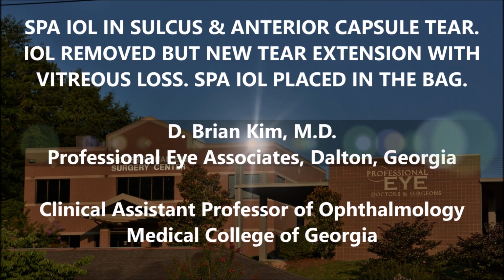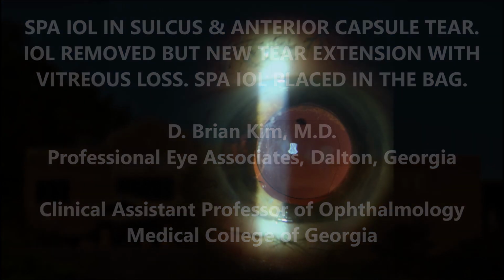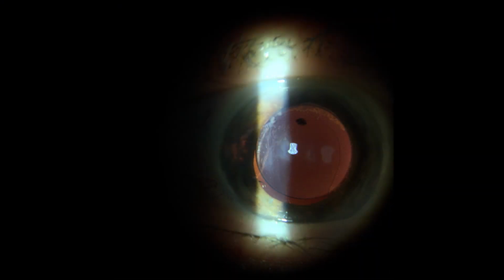I'm going to share with you this patient, and I was following her for a glaucoma, actually unilateral glaucoma in this eye. And as I was following her and doing the requisite glaucoma testing, I also noticed that she had some transillumination defects, as you see here. As you know, the transillumination defects in this particular picture are actually in the shape of the single piece acrylic lens. So this patient has a single piece acrylic lens. I believe that's in the ciliary sulcus and causing UGH syndrome.